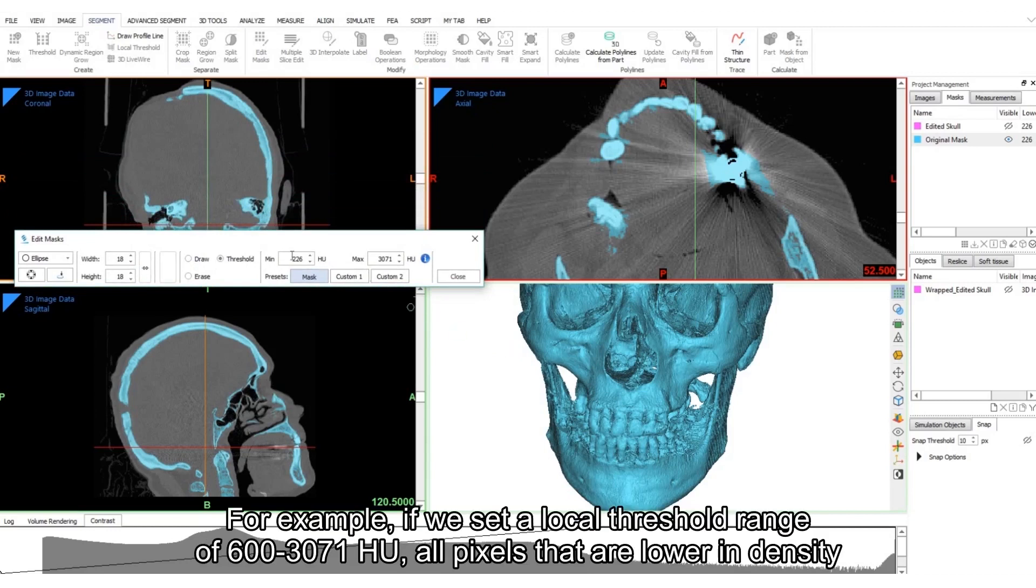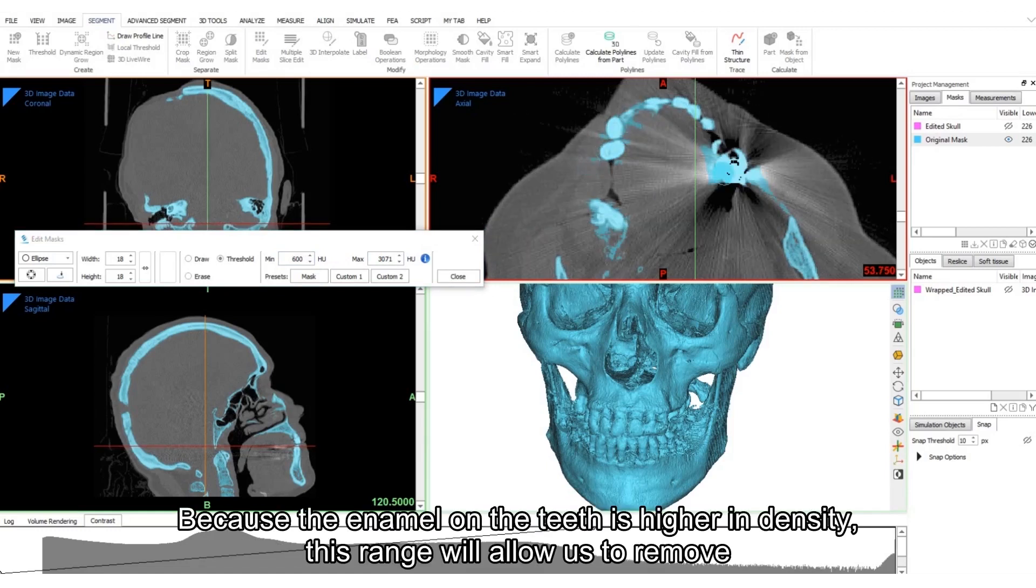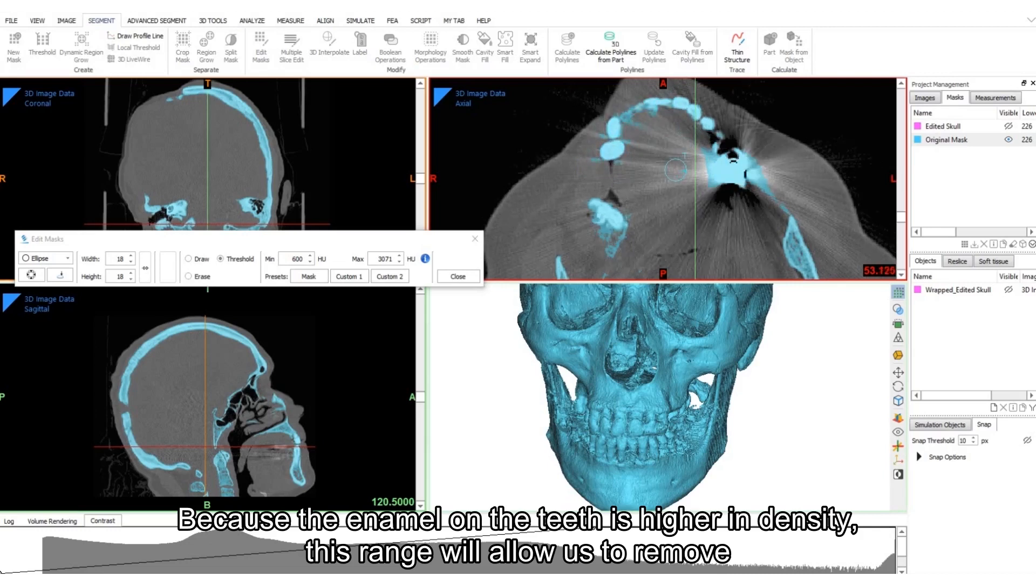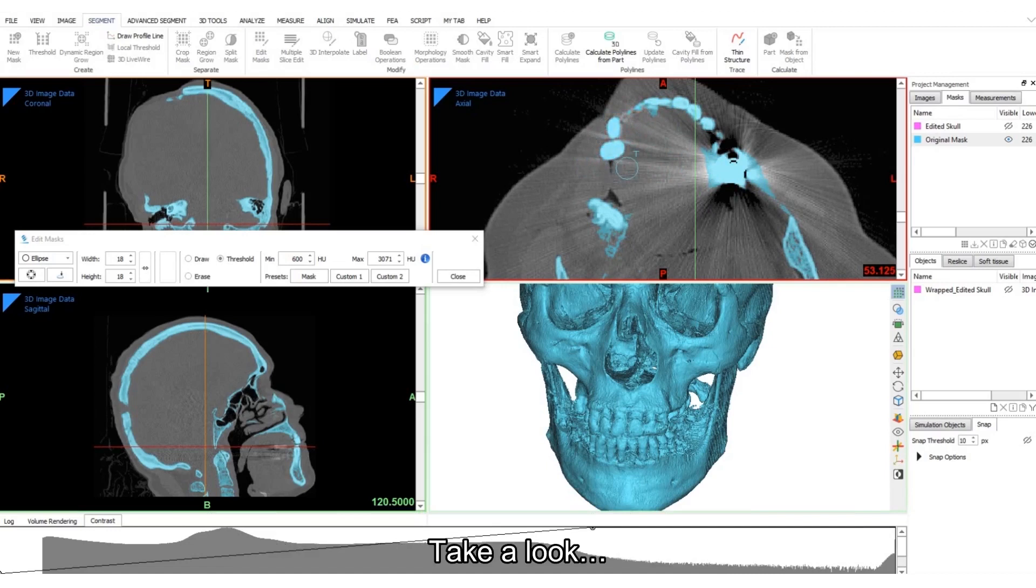For example, if we set a local threshold range of 600 to 3071 Hounsfield units, all pixels that are lower in density will be erased from the colored mask. Because the enamel on the teeth is higher in density, this range will allow us to remove some of the scatter that has a lower density. Take a look.